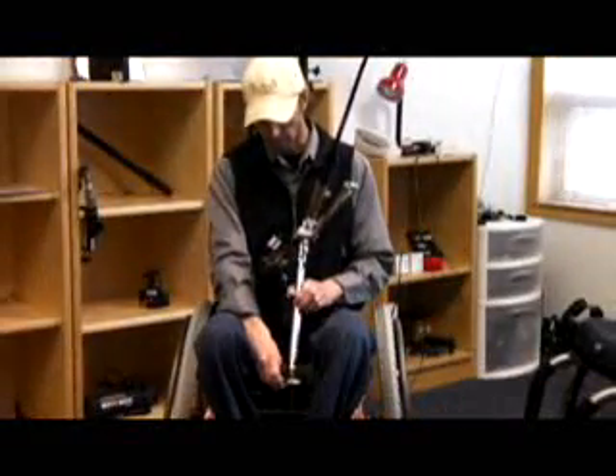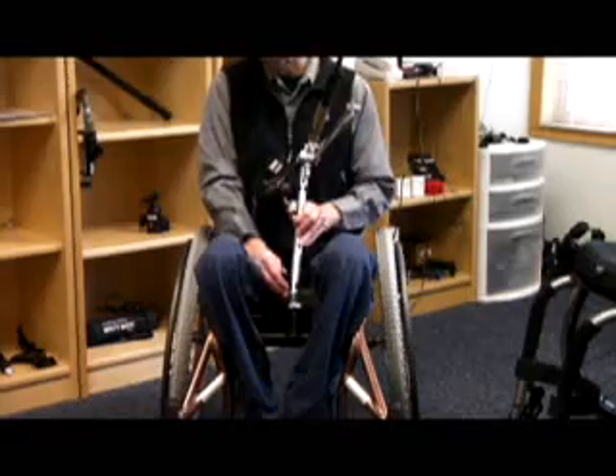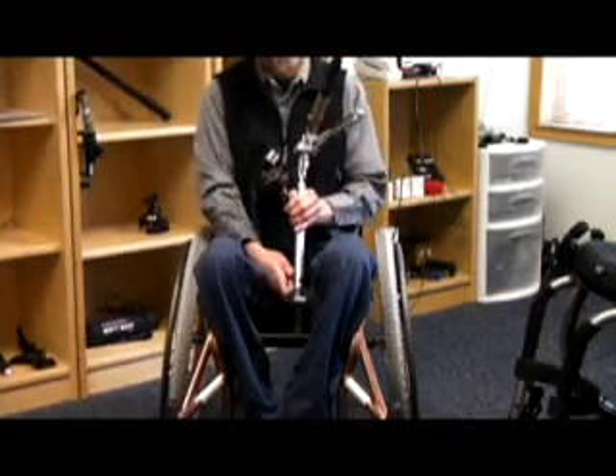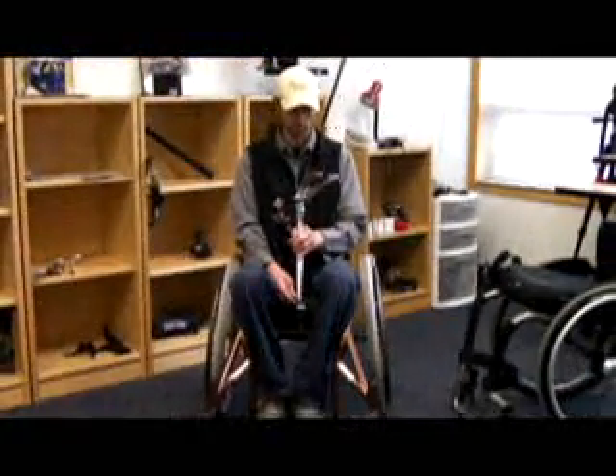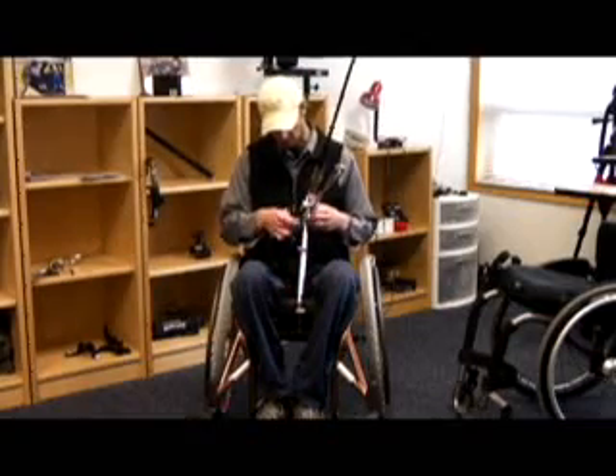You can also adjust down here at the angle, back and forth. And this one also adjusts the tilt.